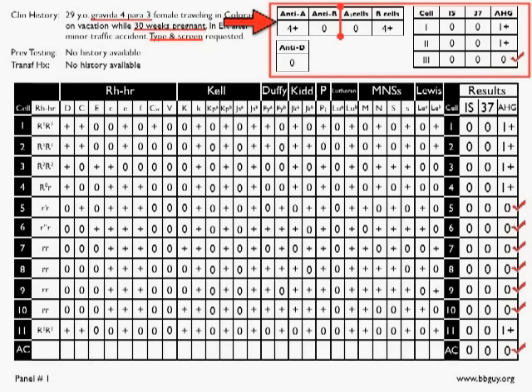The individual's anti-D testing shows that she lacks the presence of the D antigen, so we would call her group A negative. No problem there. We look over at the antibody screen, which will vary from place to place. You'll see 2-cell screens, you'll see 4-cell screens. Probably most common still is the 3-cell screen, and this is what you see here.